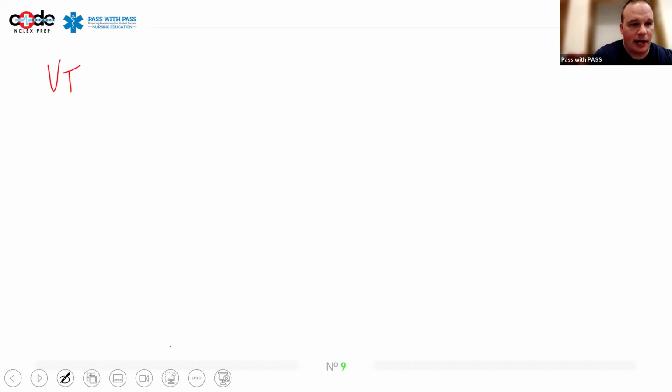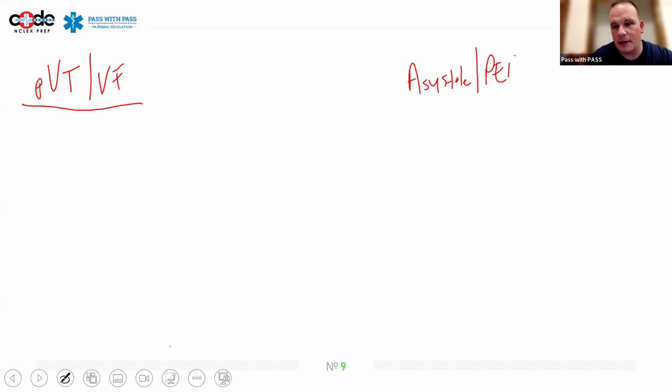I'm going to write on the screen, so it might bounce around a little bit, so bear with me. We are going to start two columns: VTAC and VFib over here, and this is pulseless VTAC. And over here I have asystole, PEA.